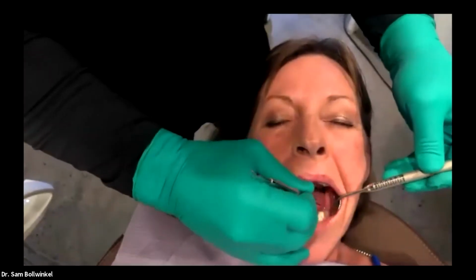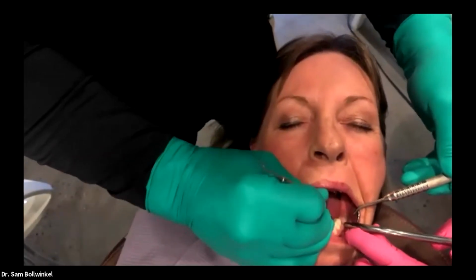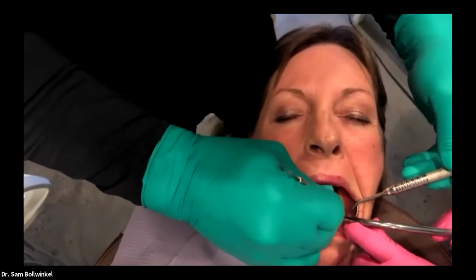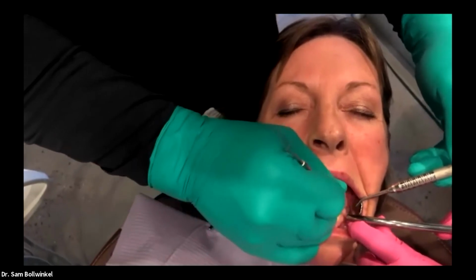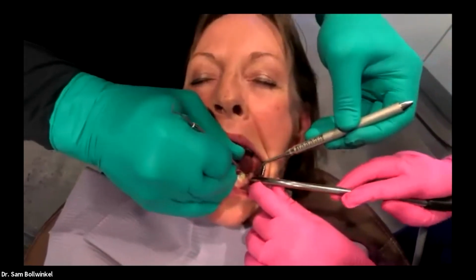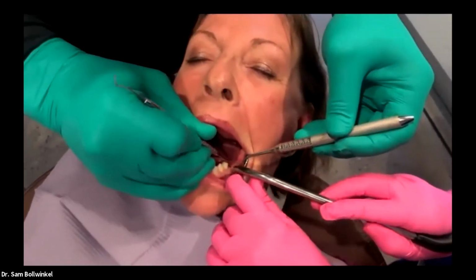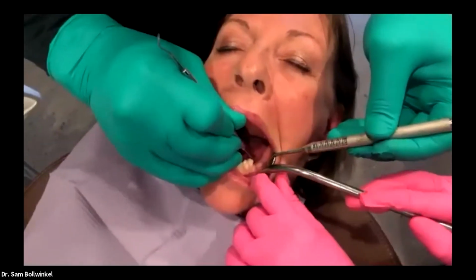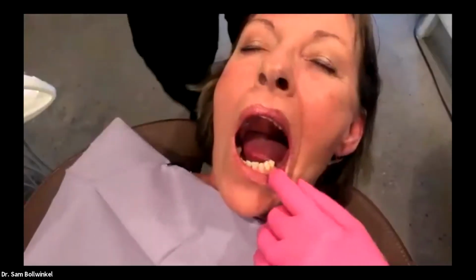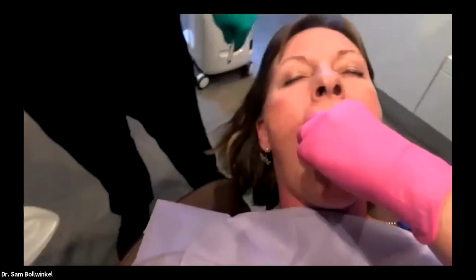Now this is going to be the part that hopefully we don't have any periodontists on board today, because this always makes them cringe a little bit. But because we have a really good ridge and the site's mature and prepped, literally we can just come in here and we're going to take that little thwarp of tissue out, and it is gone. And all of our periodontists just fainted. So with them out of the picture, we're going to walk through now and do our osteotomies.